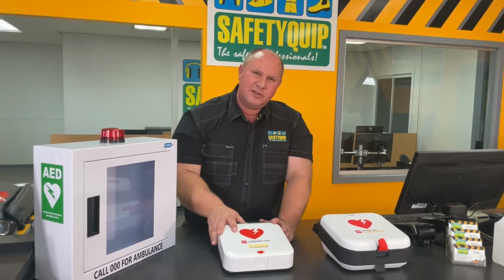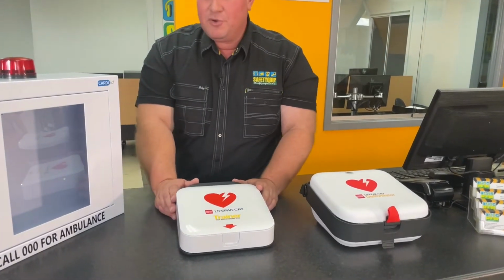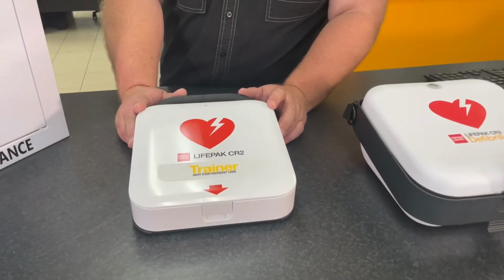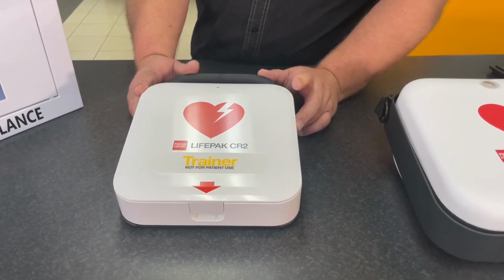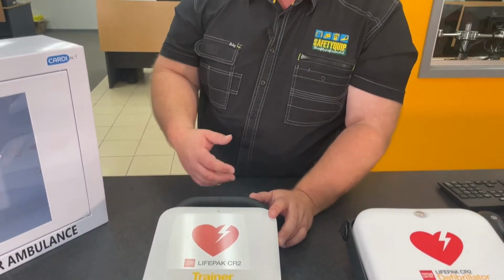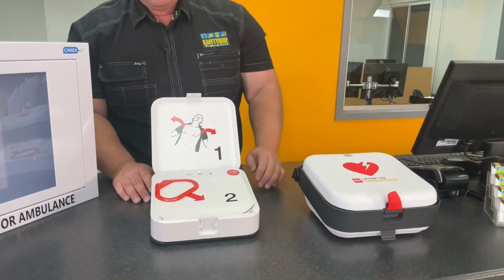So back on the training unit, what I like about this unit is it's exceptionally easy to use. Somebody with minimal training can often successfully use this unit and provide assistance to somebody that's suffered a sudden cardiac arrest. Now when I open the lid, it's powered up immediately and it will start talking to me and telling me what to do. So I'll lift that up and I'm going to pause it in a moment.